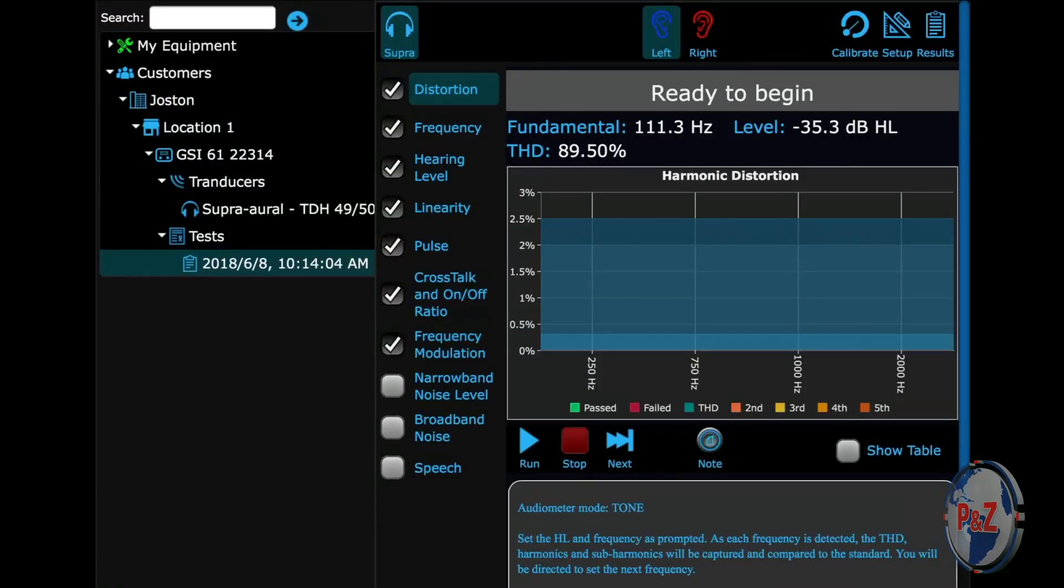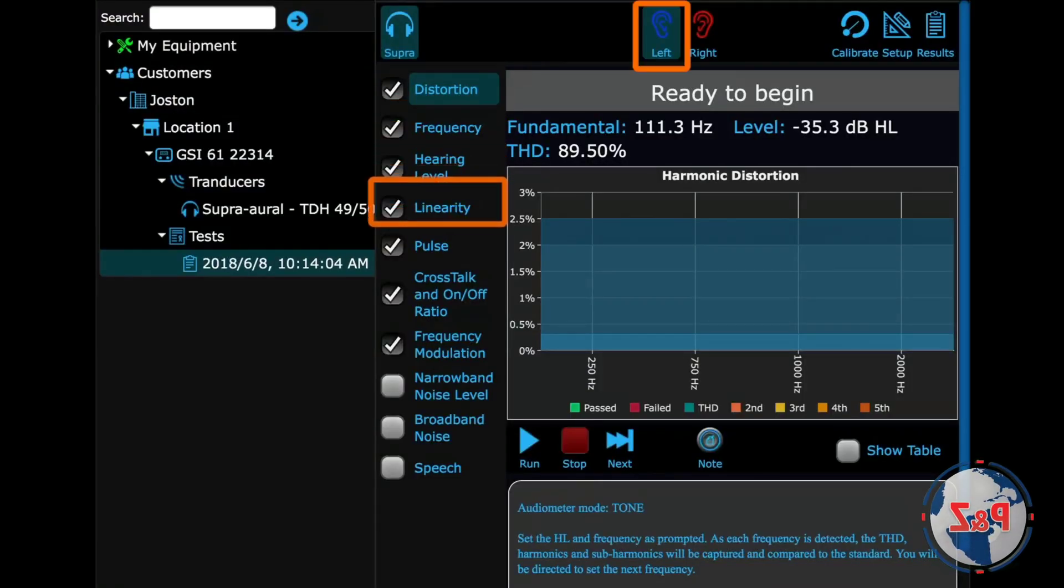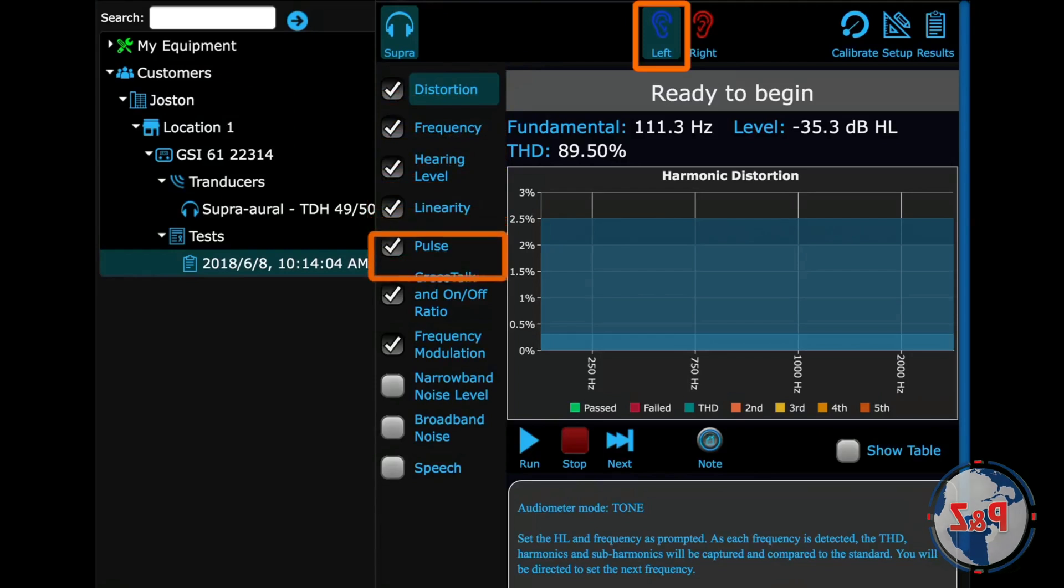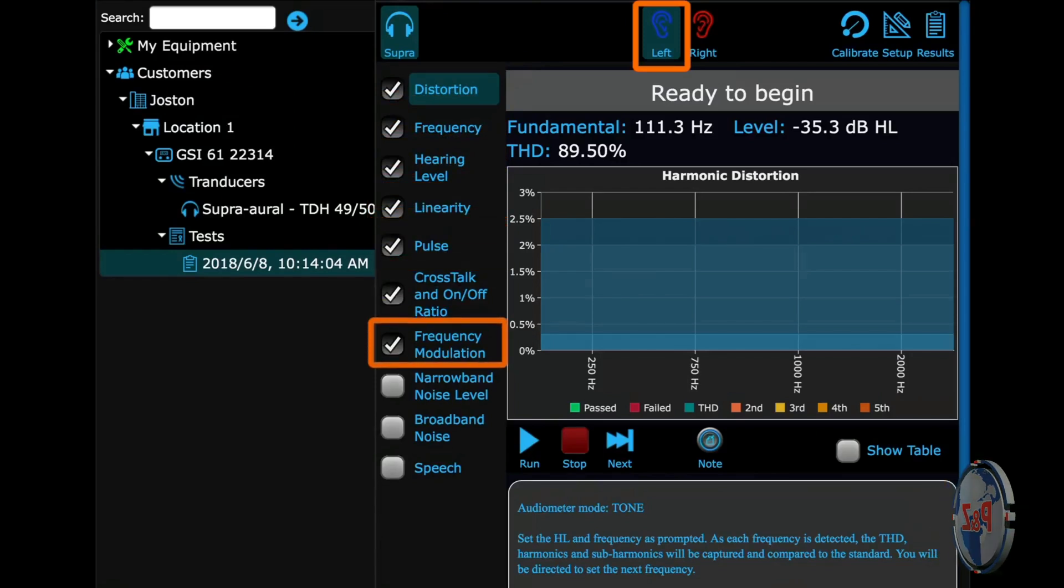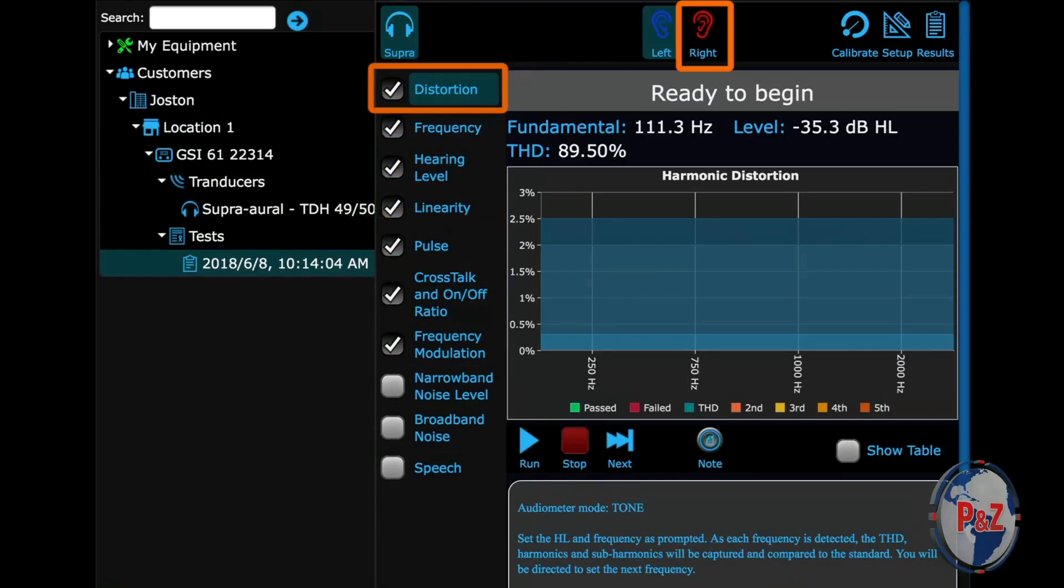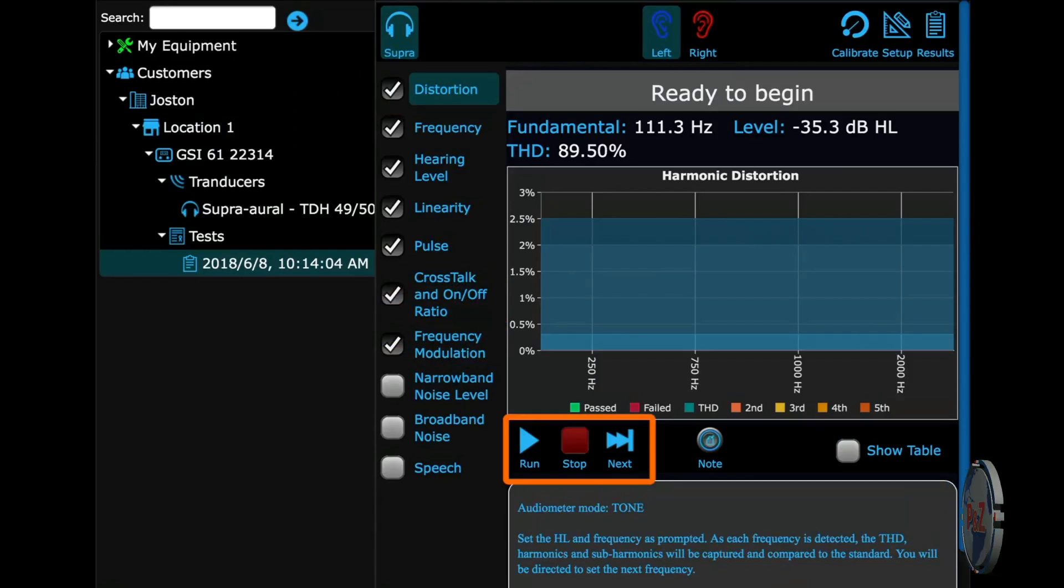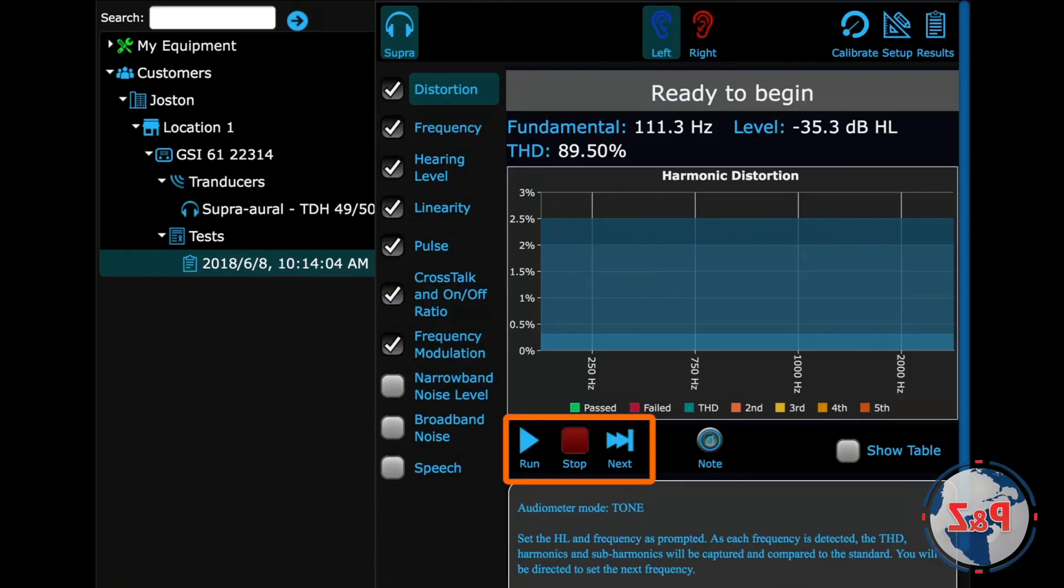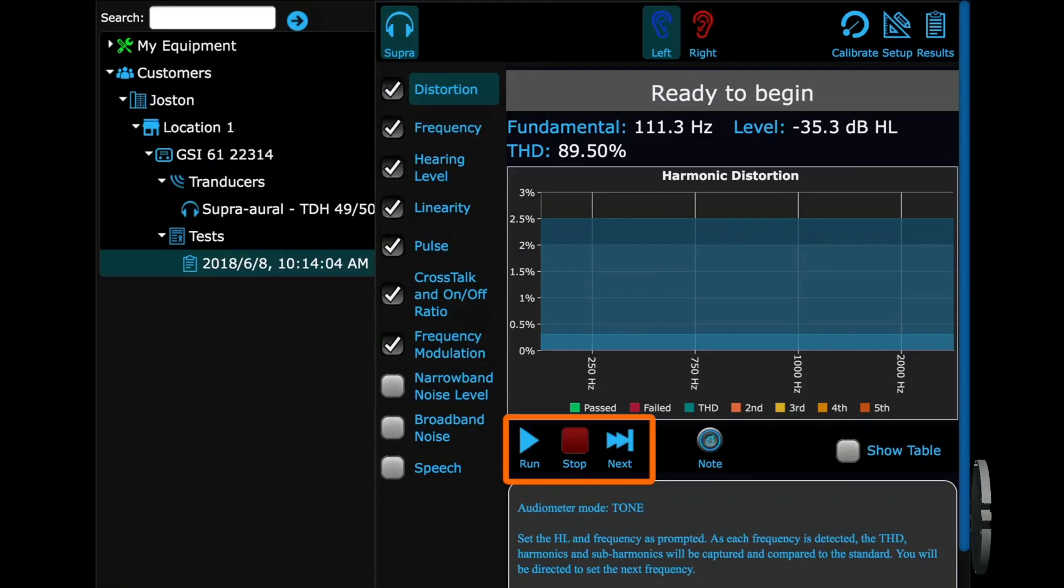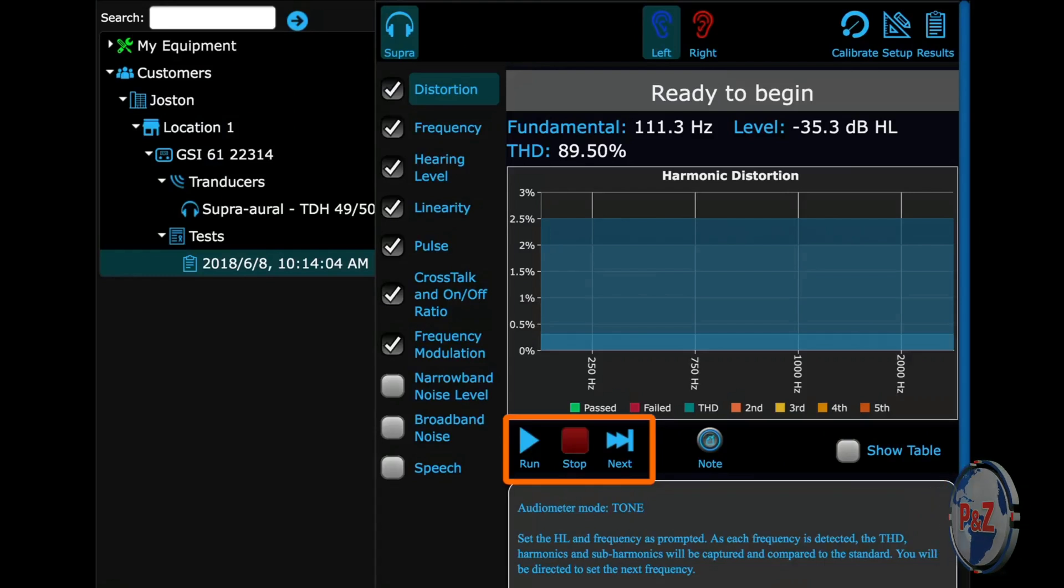Every test starts on the left side. It runs down the list starting with the first checked test. Then when it finishes, it'll start back up at the top with the right side and continue down. These are your controls. Run starts the selected test from the first frequency or step. Stop will end that test, and next will go to the next checked test in the list.